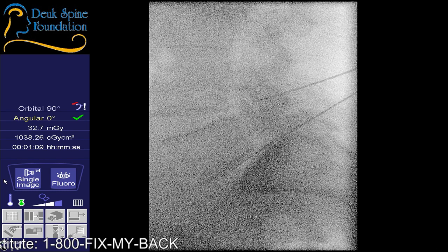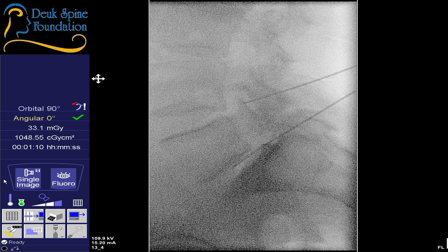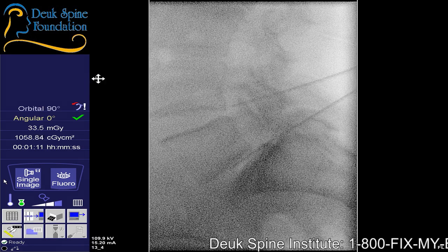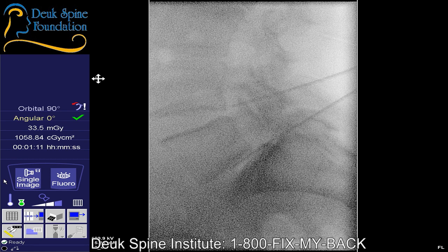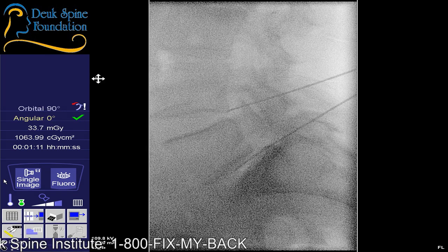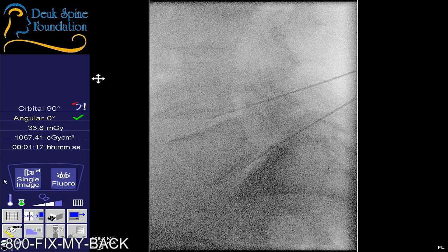Shot. So this is that facet that's unfortunately due to his listhesis. You can see it's separated. Shot. I need to go further south. Shot. This is the place where the big herniation is. Anything? Shot. AP.